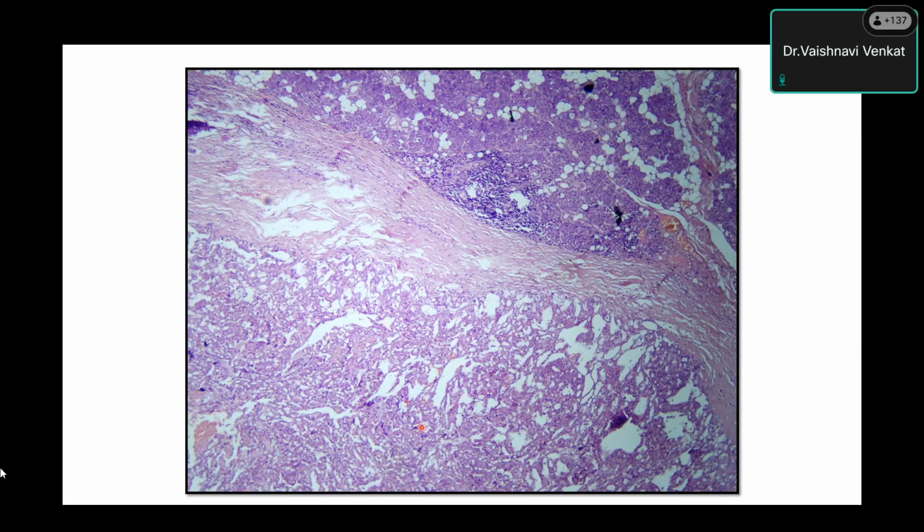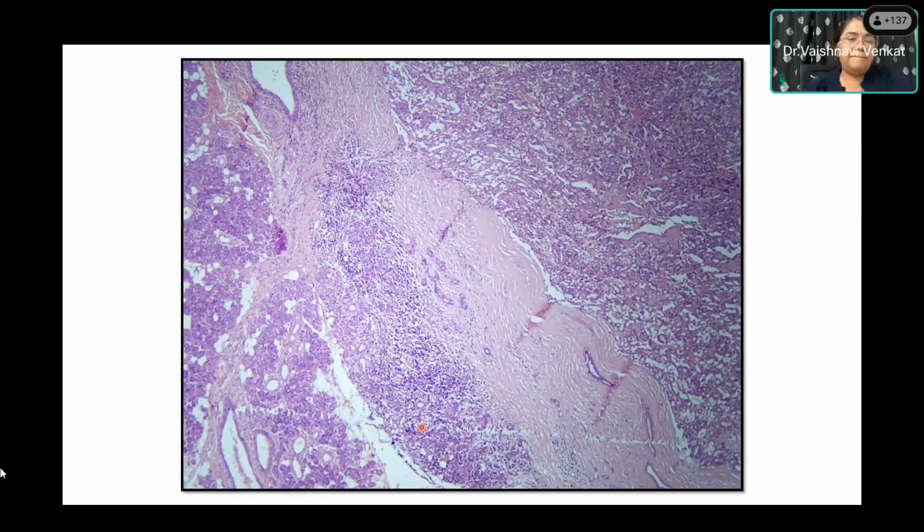So, in this part, can you describe the neoplasm? The neoplastic cells are arranged in cords or sheets, ma'am. Not very much cords. They are arranged in sheets. Sheets, okay. In between, you have some spaces, punctuated by some spaces and some blood vessels. And you're also seeing some lymphoid infiltrate, and it's infiltrating the capsule, where there is some tumor associated lymphoid proliferation.